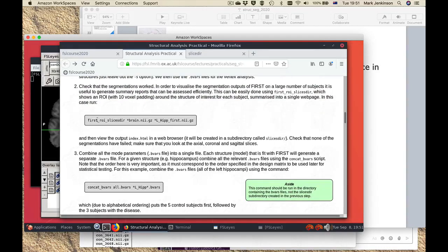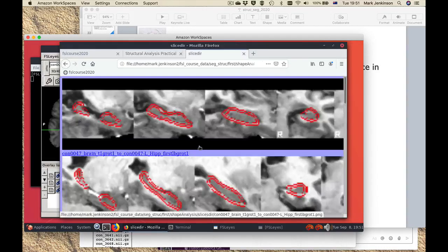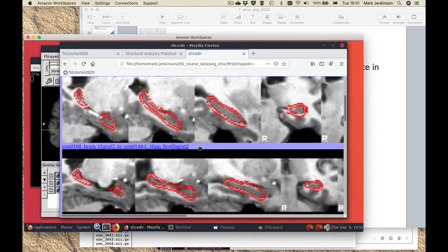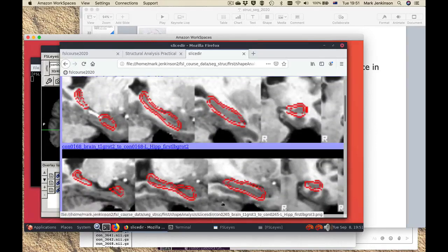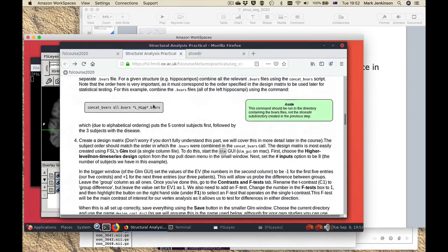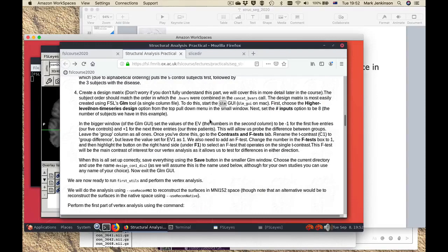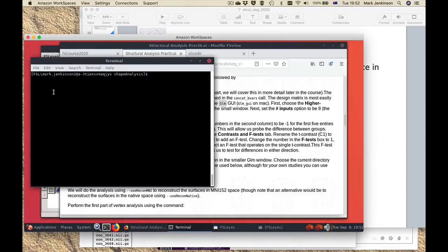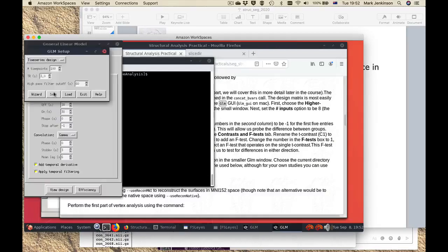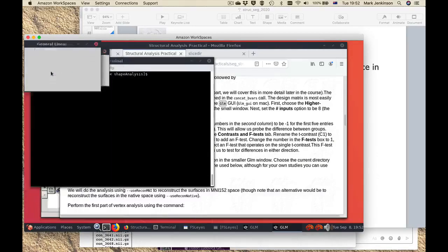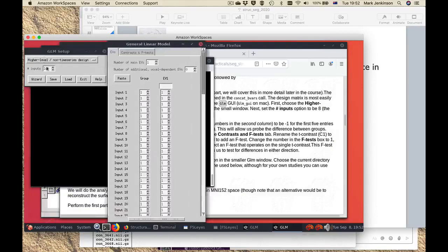To check what they look like there's a command to visualize them and you'll get an output that allows a quick visual check of quality. The next step is a simple command line which combines them all together, and then we need to set up some statistics. If you haven't done statistics before that's fine — you can simply follow the instructions and we will cover statistics in other parts of the course. This is an illustration of how statistics is actually used. To do that we start the GLM GUI and change it to a high-level design because we're looking at different subjects.